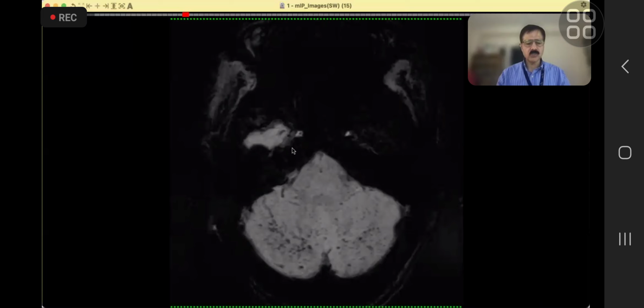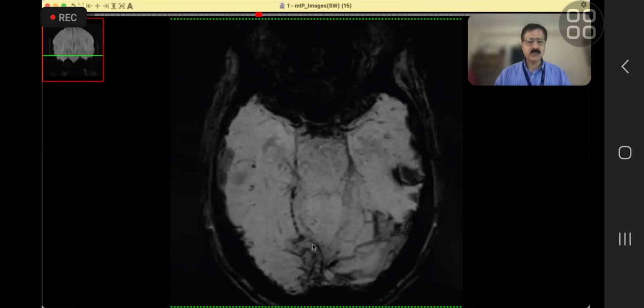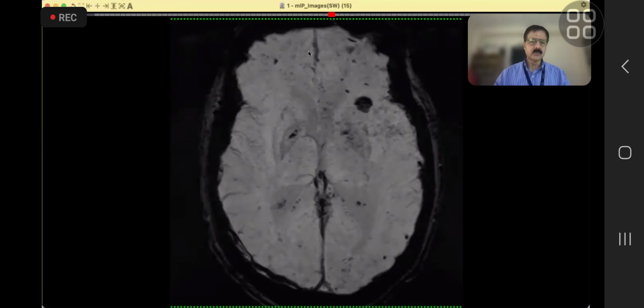Brainstem has the worst prognosis, but diffuse axonal injuries can happen anywhere, including the cerebellum. It's a rare site, but it can happen. The counter argument is that they will not be so many. This is just a shower of it. So it can be explained on grounds of fat embolism. That is what this case was about.